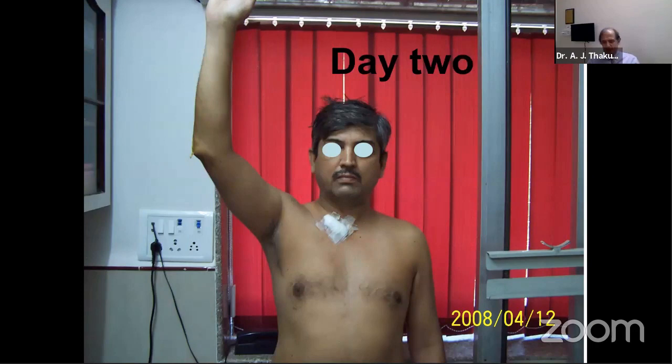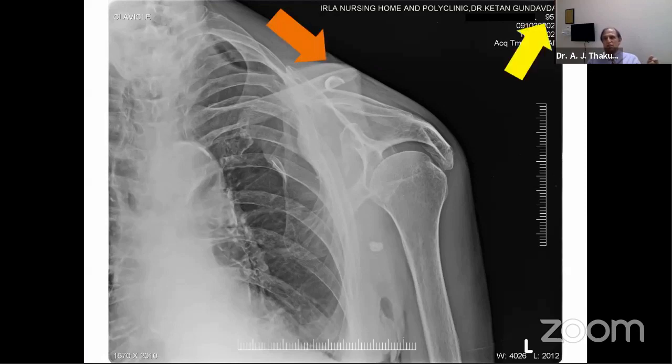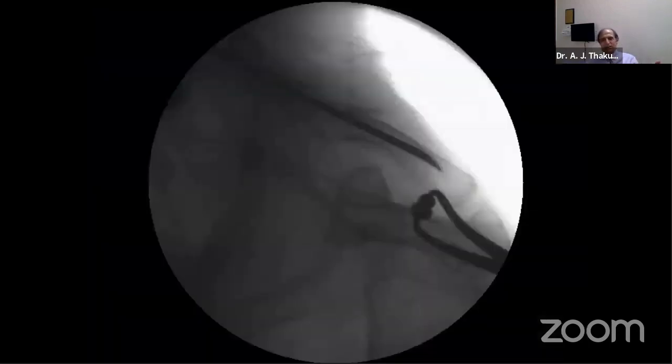He's a young patient, but very recently, just before the breakdown, I did a patient who had marked displacement. The skin was very, very thin, and this portion was threatening to just come out of that. His age was 95. It took a while for me to convince the family that this is required, but then they fortunately agreed. We were able to do it in the shortest possible time with minimum trauma.